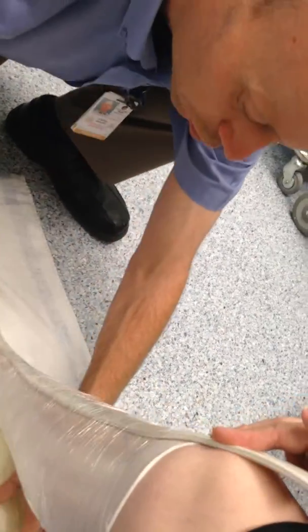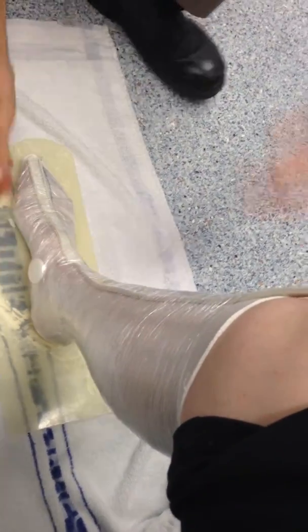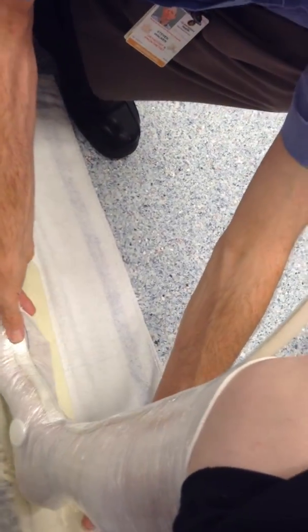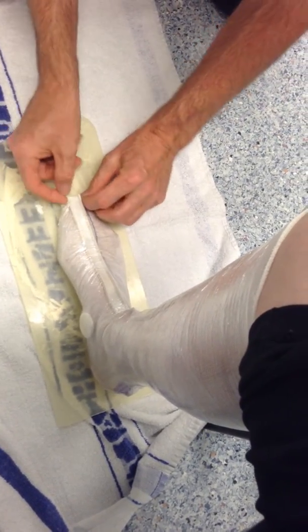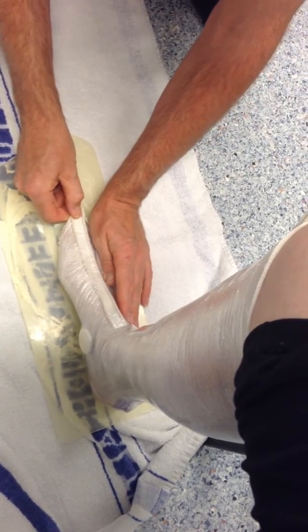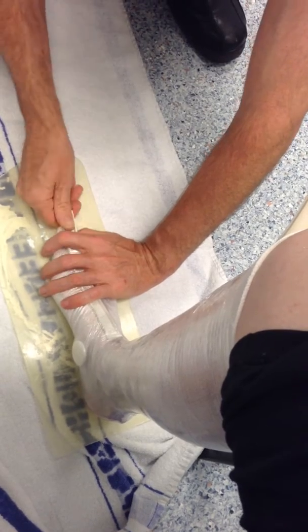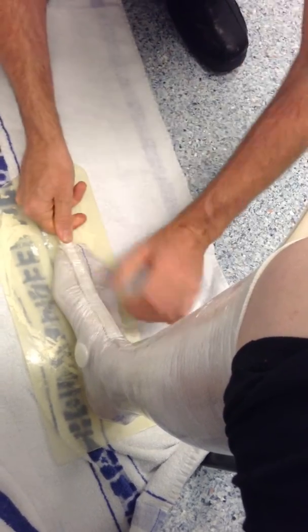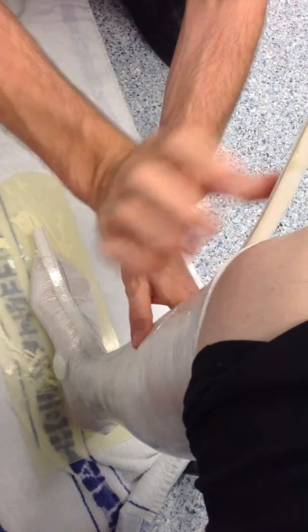I'm just going to get you to put your foot back onto there. What we're looking at trying to do is get your knee so it's above the ankle, so we need to bring your foot back as far as we can get it. That's looking pretty good. We might just have to give that a little bit of a point — creasing a little bit just on your ankle. You must have a good back to be able to bend down all day long. I've developed it — it's a little bit more flexible.